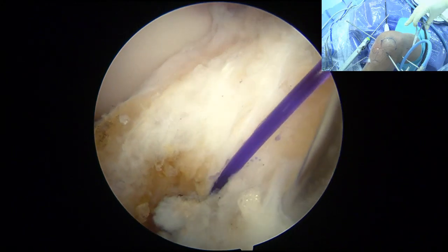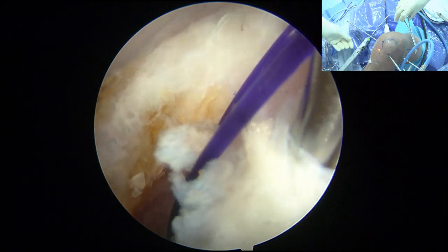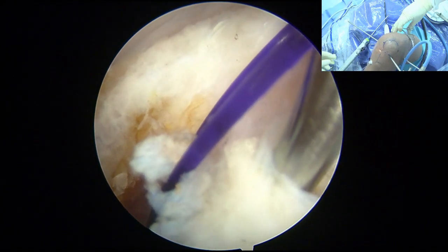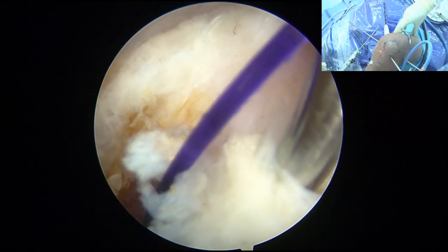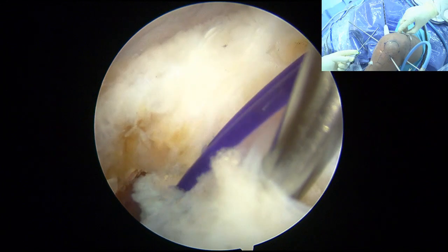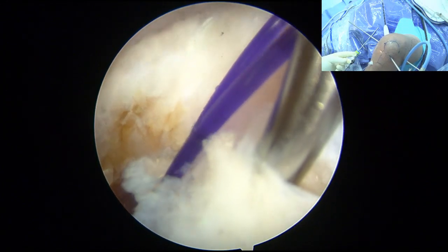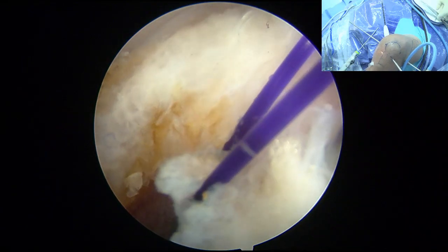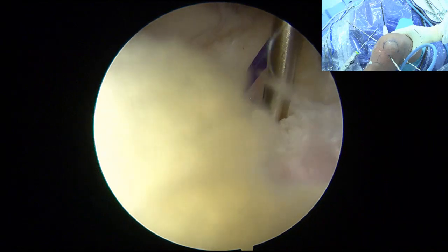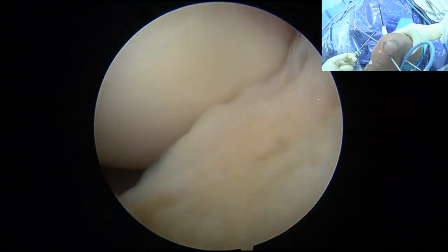然后，这个前内缝，骨隧道的前内缝就留给了移植物。So now the next step is to pass the graft with the Ultra Button, right? 然后用 Ultra Button 和移植物呢，穿进隧道。Okay. So I think Ultra Button just launched in China for 1 year, right? 那据我了解呢，Ultra Button 是一年前在中国上市的。Okay, good.